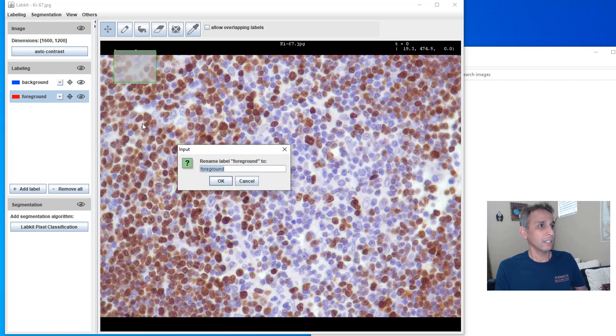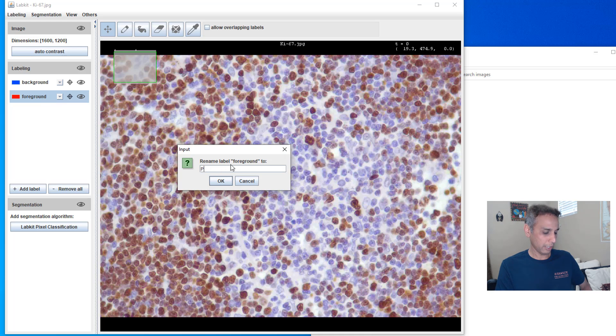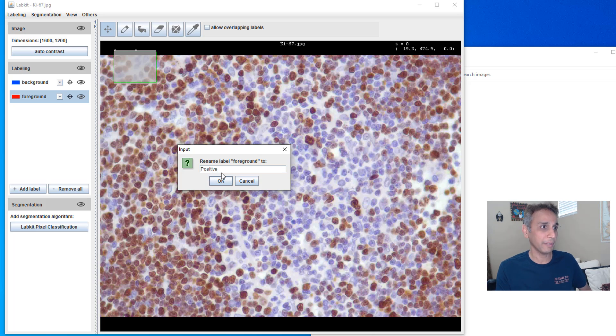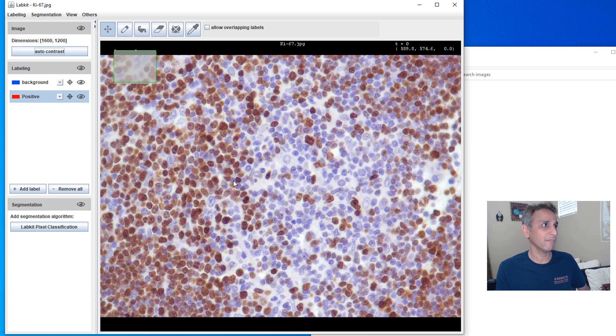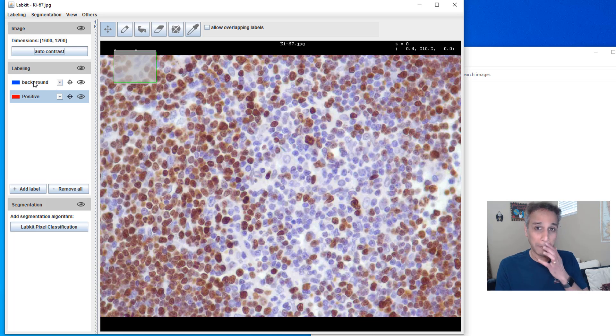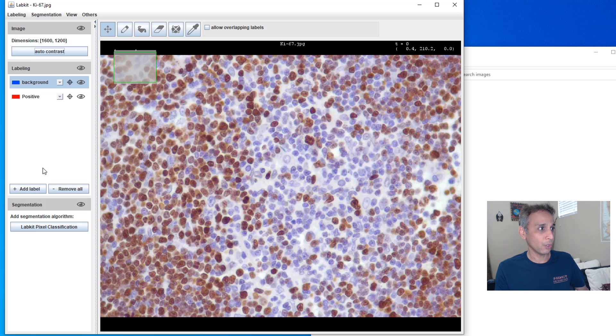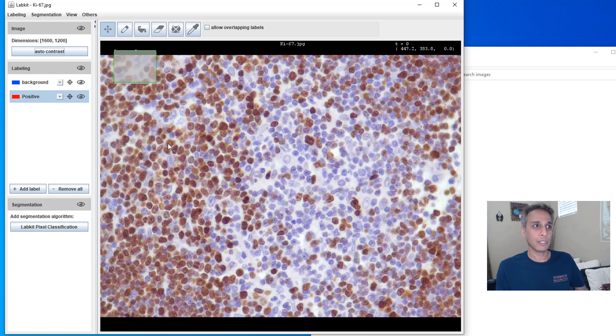I'll call this positive because I'm going to paint the brown nuclei right there so let me call that positive and the other one can be background by default. You can add many, many labels, multi-labels, it's pretty straightforward.